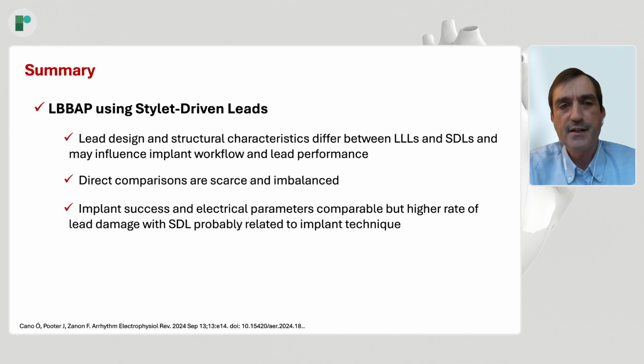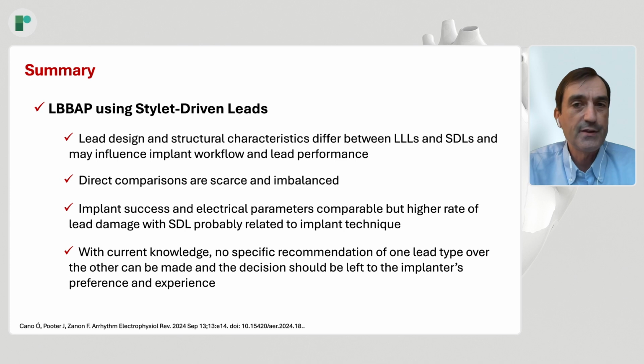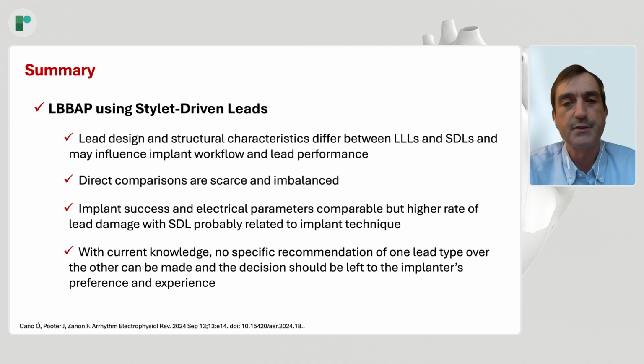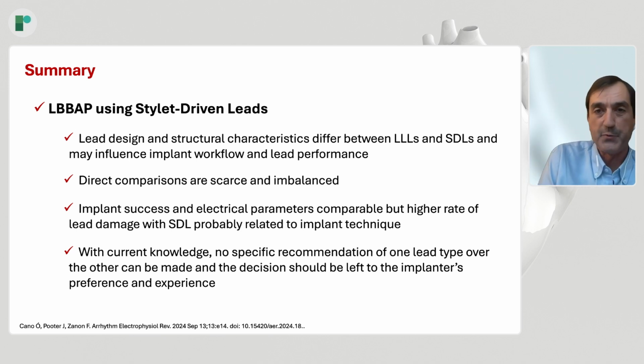Implant success and electrical parameters are comparable between both lead types, but there is a higher rate of lead damage with the stylet-driven leads, probably related to the implant technique. With current knowledge, no specific recommendation of one lead type over the other can be made, and the decision should be left to the implanter's preference and experience.